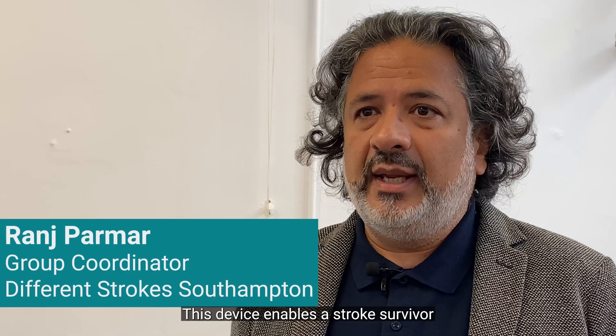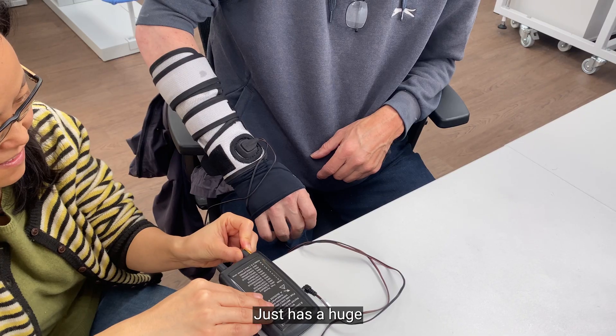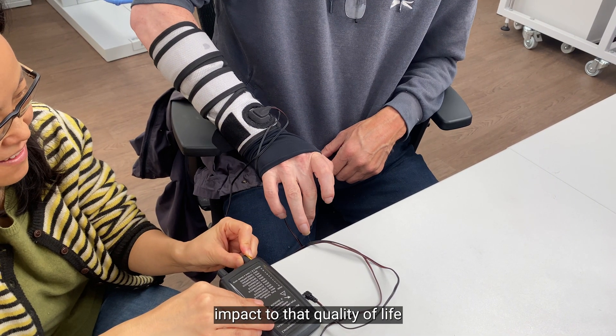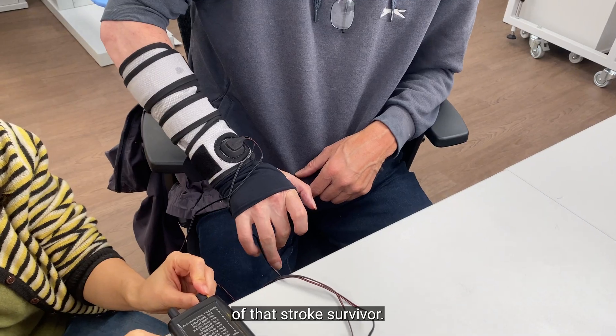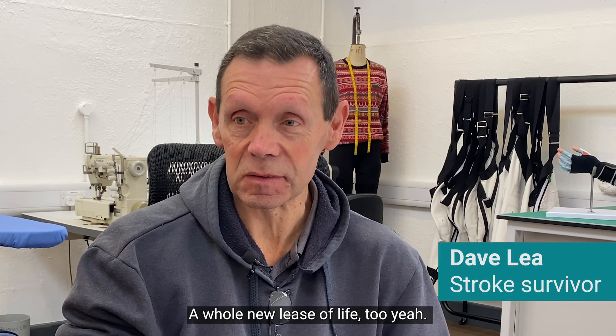This device enables a stroke survivor who's impaired physically to be able to open and close that hand. It just has a huge impact on the quality of life of that stroke survivor — giving them a whole new lease of life.